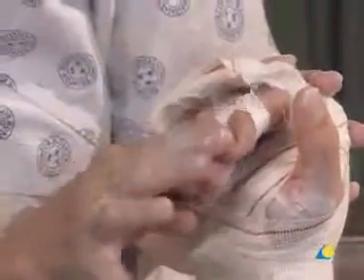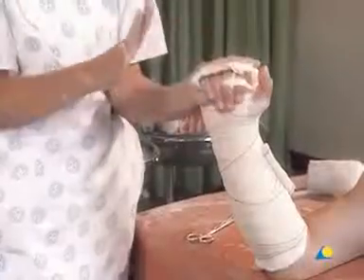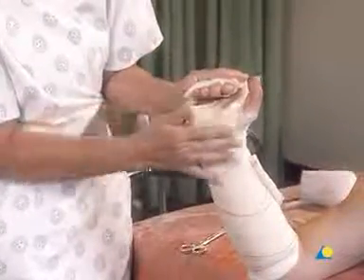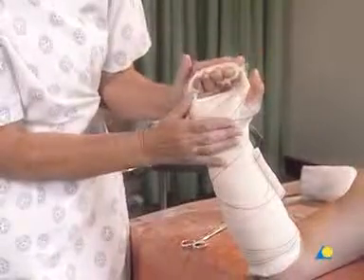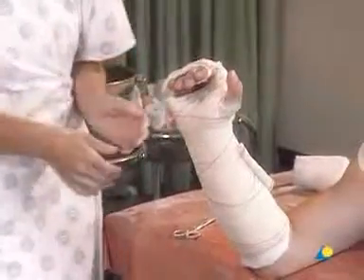The application of the extension block splint is now complete. The exercises for the patient may now be explained and demonstrated. The reduction may be verified with an x-ray. The splint should be removed after a maximum of three weeks in order to prevent stiffness.